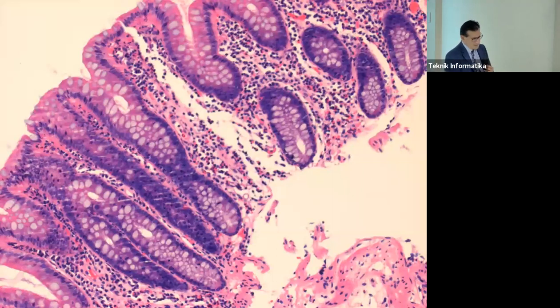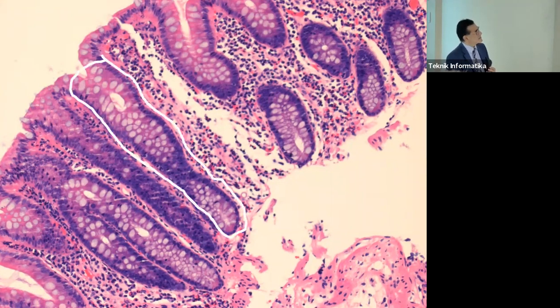And this is the kind of thing I mean. Here again, I'll show you as a pathologist. This is a picture of a normal colon. And what I've done is grouped all of these things together. So the primitive objects will be the cells which are forming here. And these are all arrayed in a row here, going around up here as well, and so forming what we would call this gland. That would be the high level structure that we're looking at. The other thing I want to point out is, oh, actually, I'll point that out in a minute.